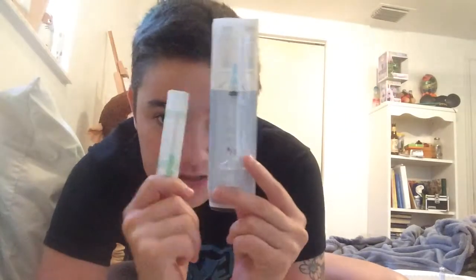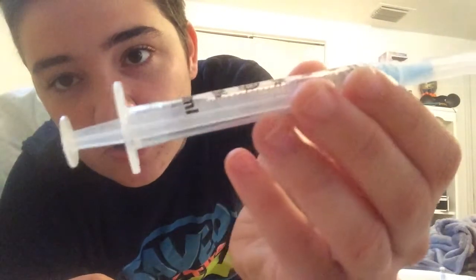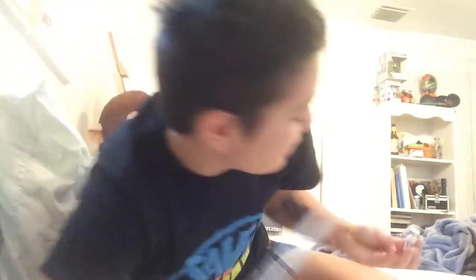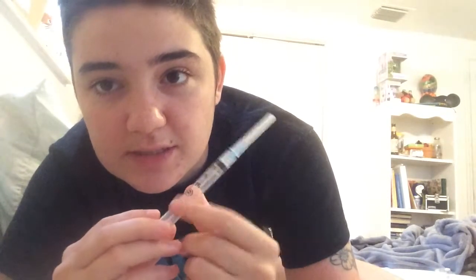This is my testosterone. I have a band-aid ready to go and then I have two different needles. Currently I have a needle which is going to be changed. I just have these for my first couple because this one isn't as precise. As you can see here, it goes all the way up to three milliliters. My prescription for testosterone is only one milliliter, so having three is kind of useless. So eventually I'm going to switch needles and they're going to give me ones that have one milliliter instead of up to three. That way each thing is going to be more precise.